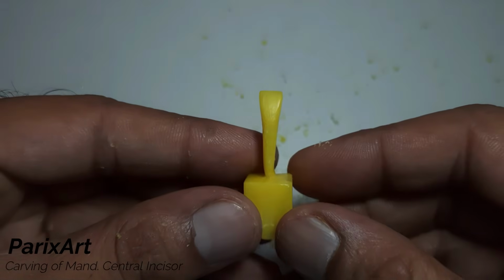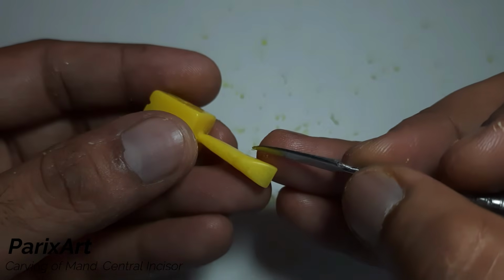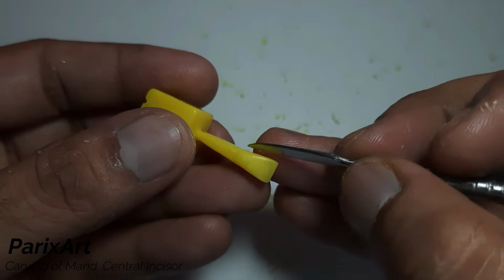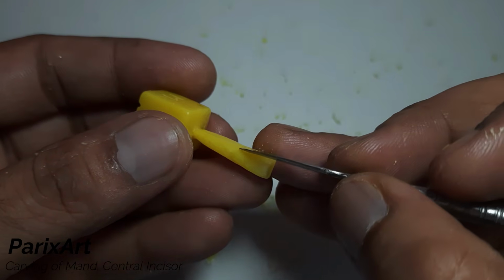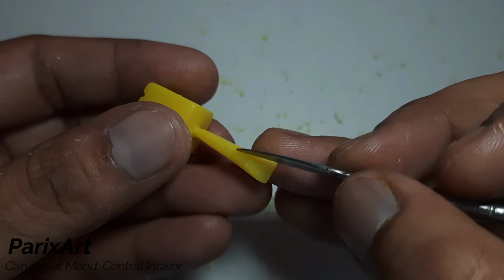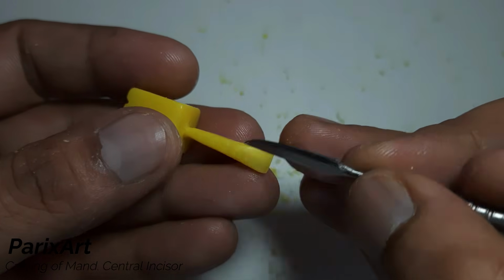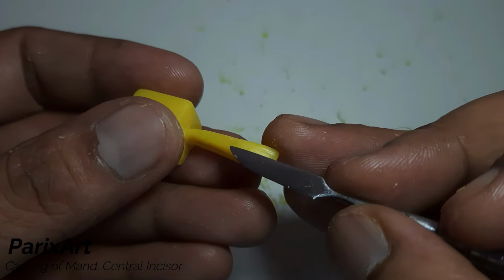Just the last thing, to get a little more mesio-distal convexity at the cervical and the middle third. See the angle of the carver blade. Run the carver mesio-distally.